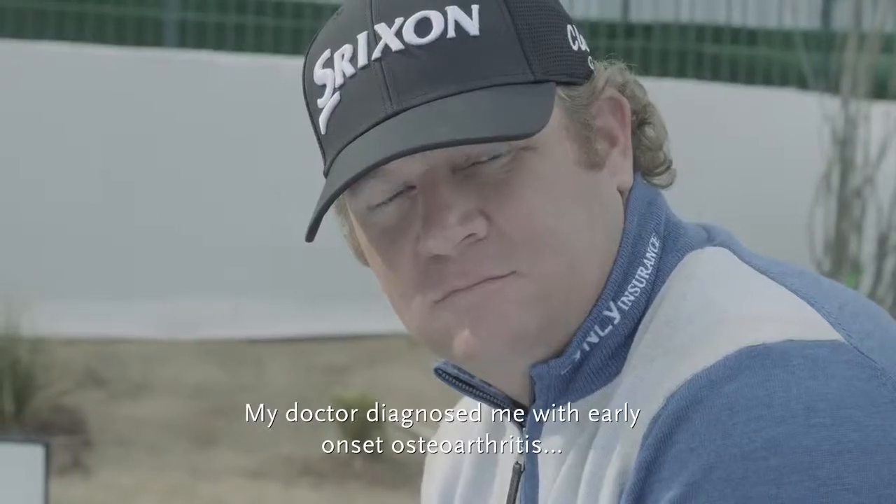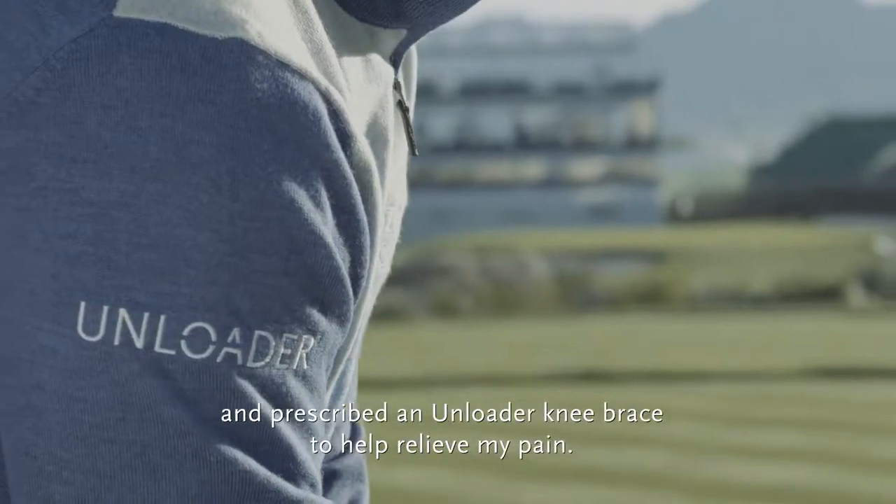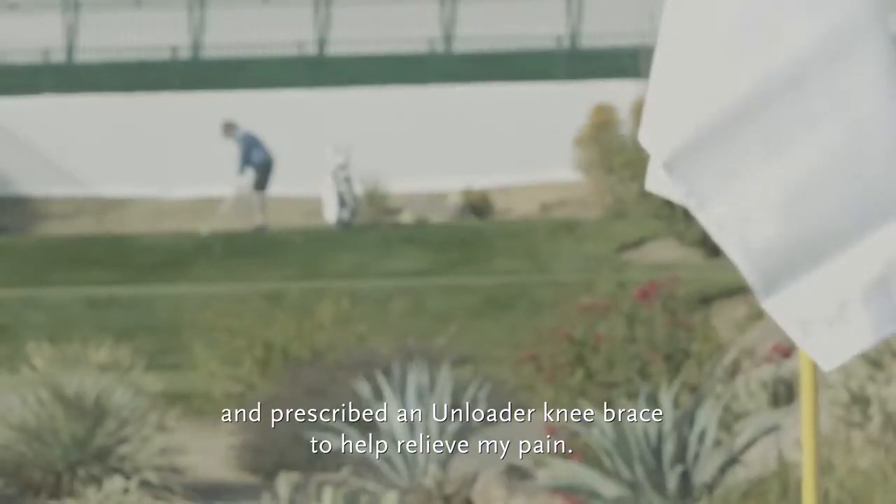My doctor diagnosed me with early onset osteoarthritis and prescribed an Unloader knee brace to help relieve my pain.